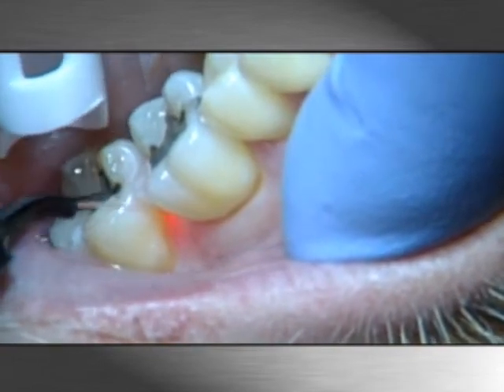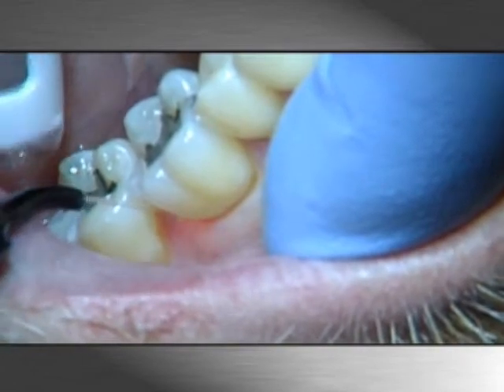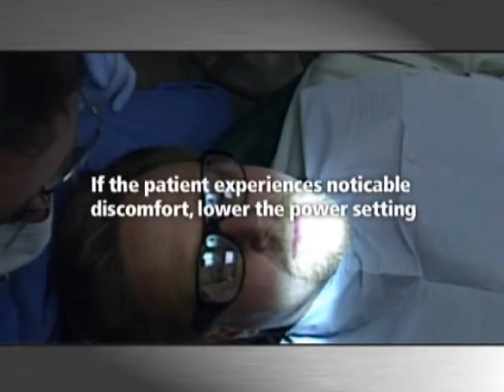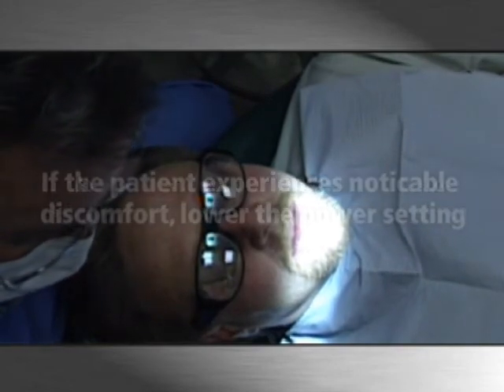Another indication of the complete removal of granulation tissue is the beginning of oxygen-rich or red bleeding from the treated site. If the patient experiences noticeable discomfort, lower the power setting. Anesthetic may be administered.